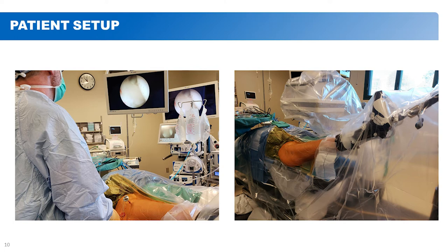I've also got an x-ray machine that's draped over top of the patient to confirm that I'm in the right spot with my surgical instruments.